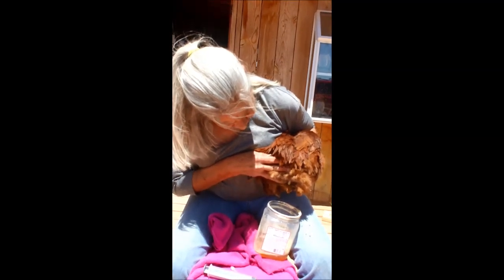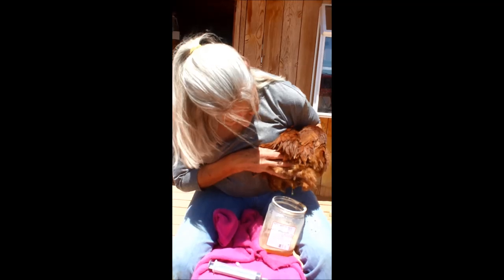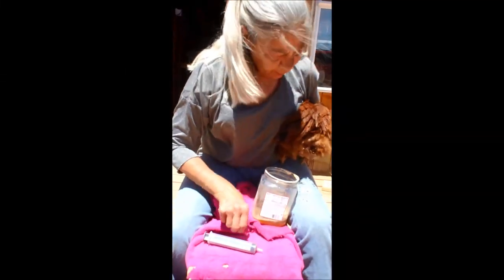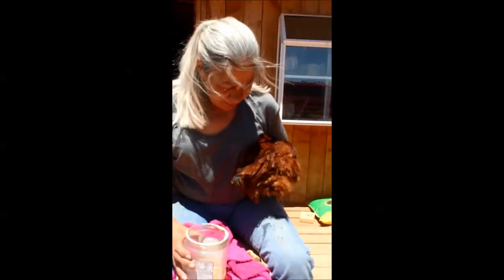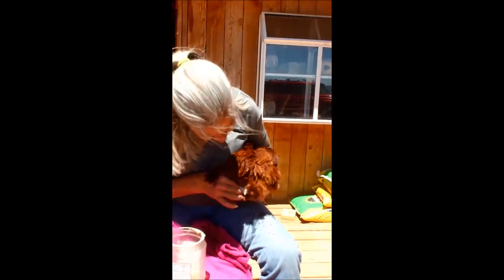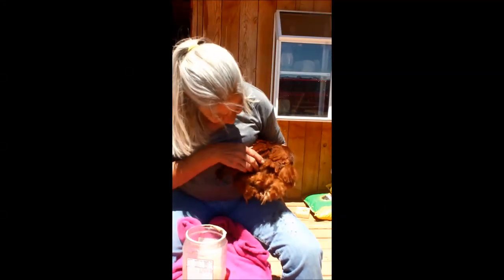So I'm going to stop at this point. If you drain off too much at once, you can send them into shock. So I'm going to stop what I'm doing here. Pull that needle out. Put a protective cover on it. I feel like I've gotten about half of it out of her, and I don't want to drain too much. I'll use my little cotton alcohol here and wipe her off. She may continue to drain, depending on how quick that little injection site heals up.